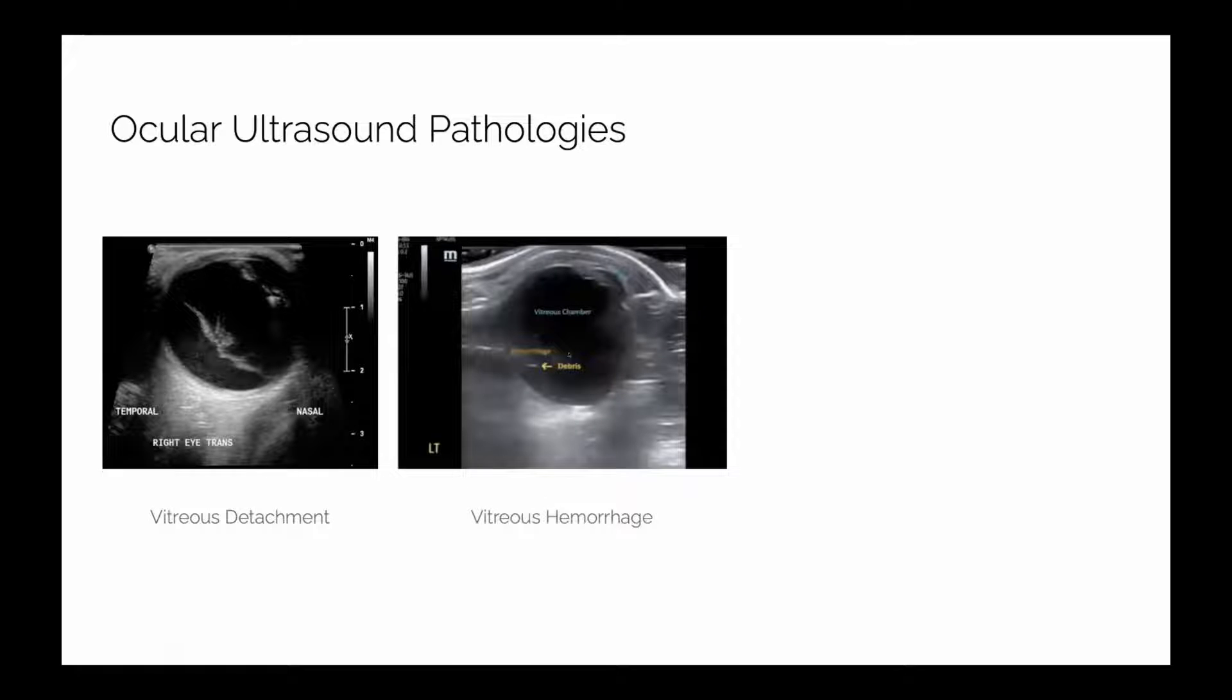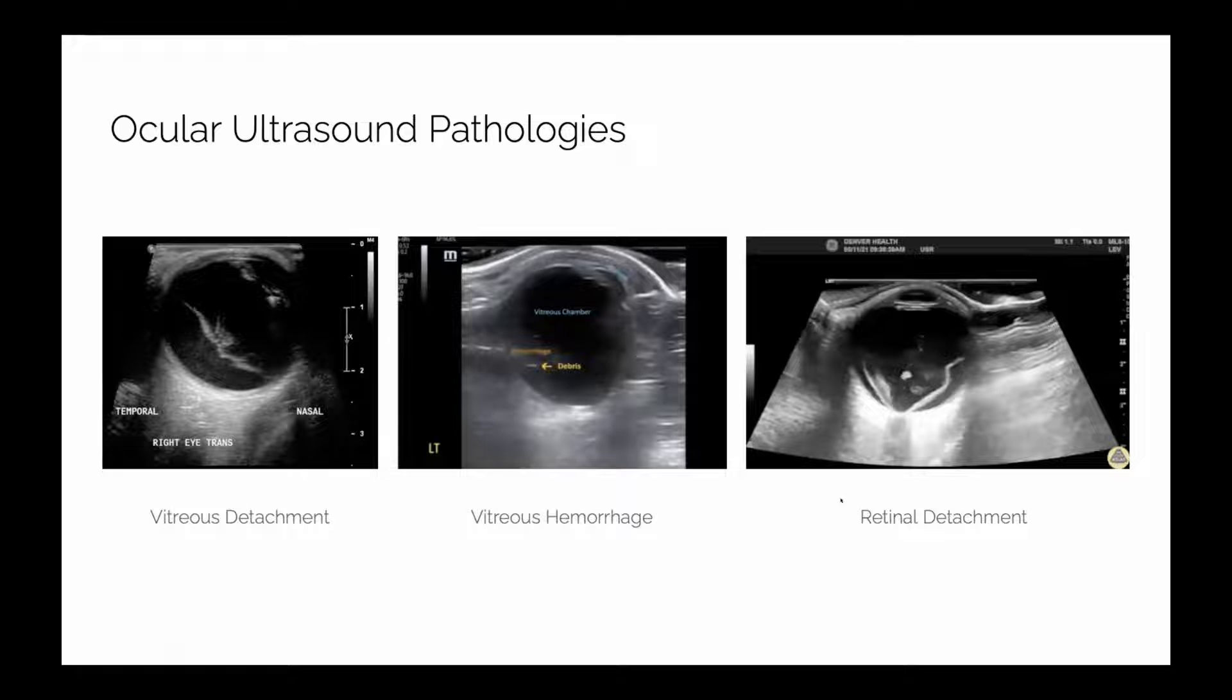Sometimes it can come along with a little bit of blood. Sometimes the blood's just there on its own. You can see a little bit more hypoechoic stuff in the middle of the vitreous, a little bit of blood there. Here's the RD where you can see that it's actually attached to the optic nerve. That's the key difference you want to make between vitreous detachment and retinal detachment. Two very different things with very different prognoses.